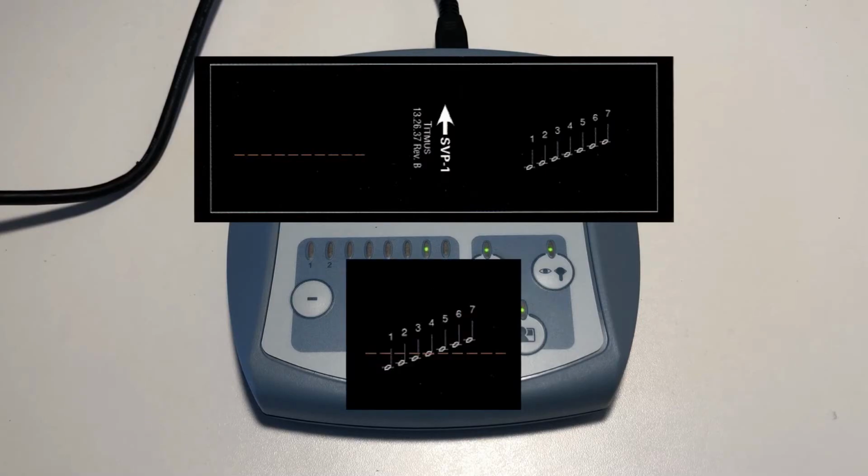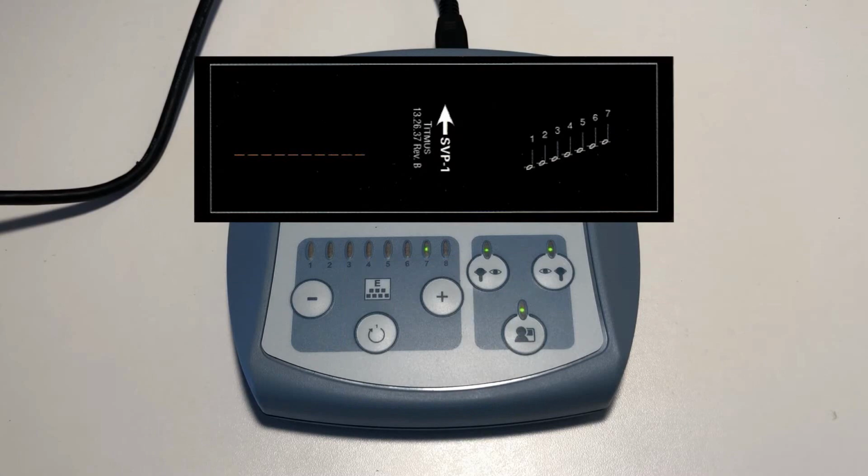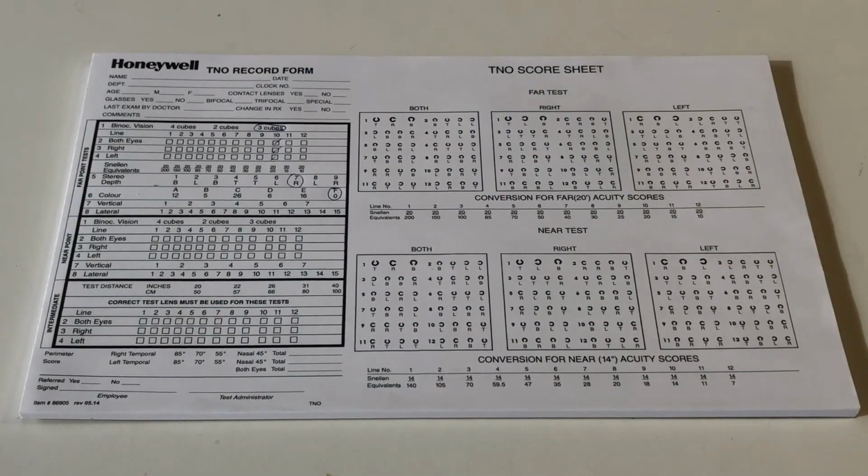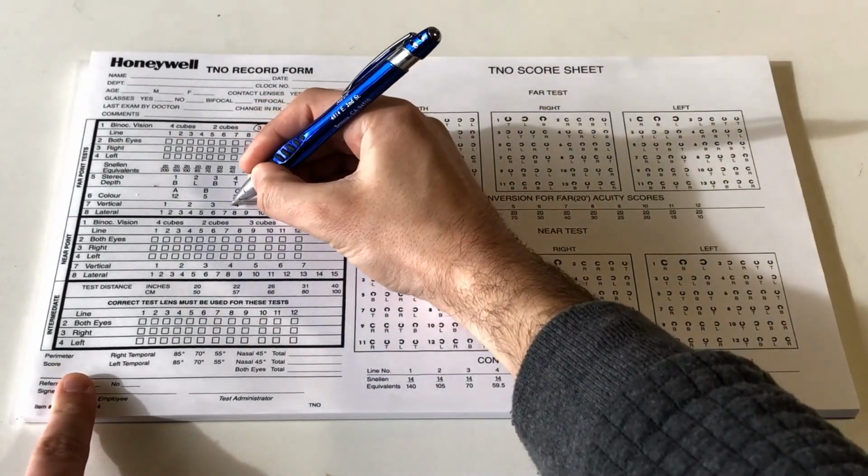The patient should see a combined image that looks like this. Say to the patient, when you look at the slide, you should see a red dotted line passing through a musical note with a number. Tell me which number the red dotted line passes through as soon as you see it. You'll want to ensure that the patient answers quickly, as the line may appear to drift over time. Record the number on the record form.